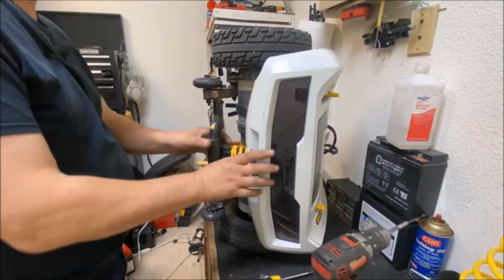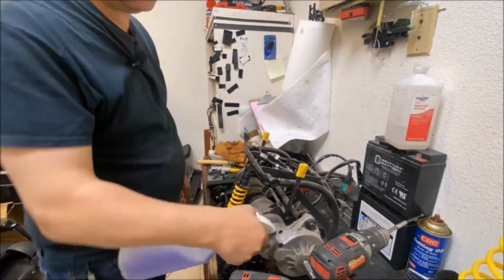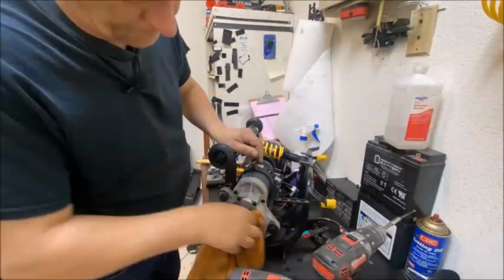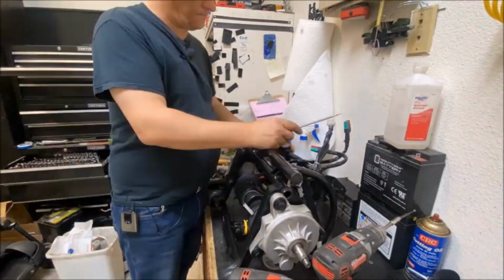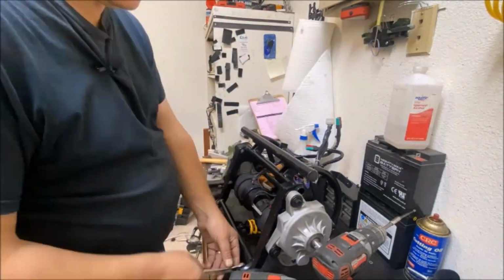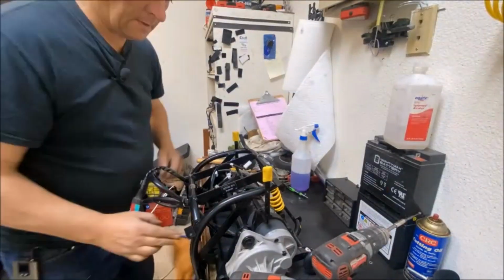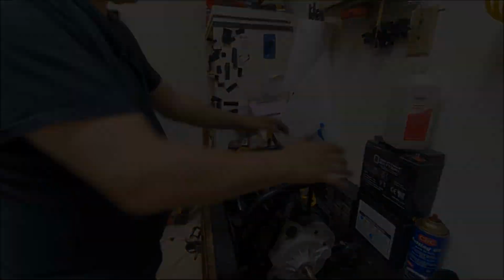Now with the rear section, the rear wheels don't have bearings because they have a lock key on the shaft, and all the bearings are inside of the motor, transaxle, or in this case the gearbox for the wheelchair version of this scooter. So that's not really an issue, but I always still clear any hair build-up, carpet build-up, that kind of thing in between the wheel shaft and the gearbox itself, because it has a rubber seal around the shaft and it can still pull the grease out of there. So it's best to keep on top of it and keep any debris clear.